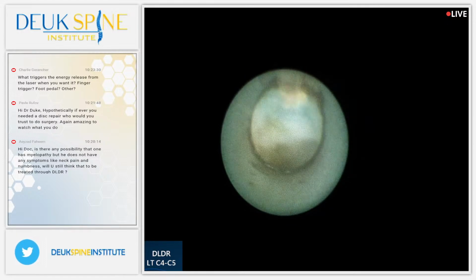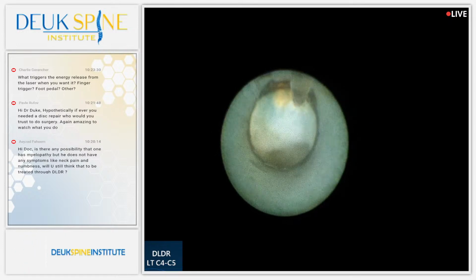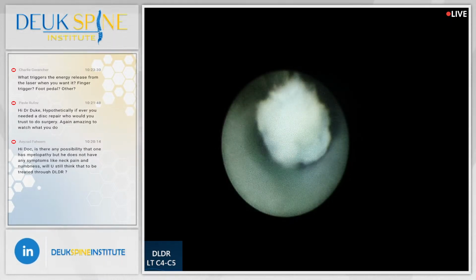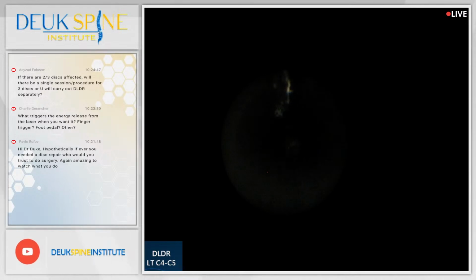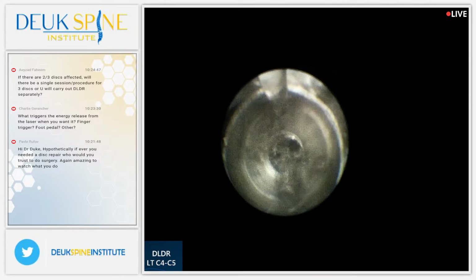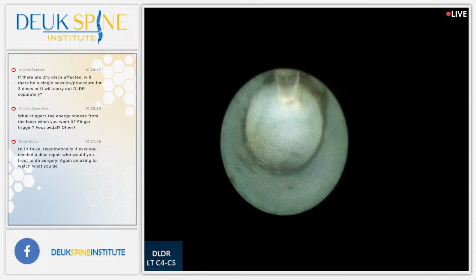Now there's still some more herniation here I want to get out, but we're just about done with her surgery. This is a newer herniation. See the blue? But then, oh, look at that. That's beautiful. So we got a big herniation over here too. A lot of times the MRI won't show everything because the MRI was done a few months ago, right? So people's disc herniations are dynamic. They're not static. You don't get a herniation and you're done. They keep herniating. So from the time of the MRI until now, she may have herniated more, and that's what I'm seeing. It looks like there's more herniation.